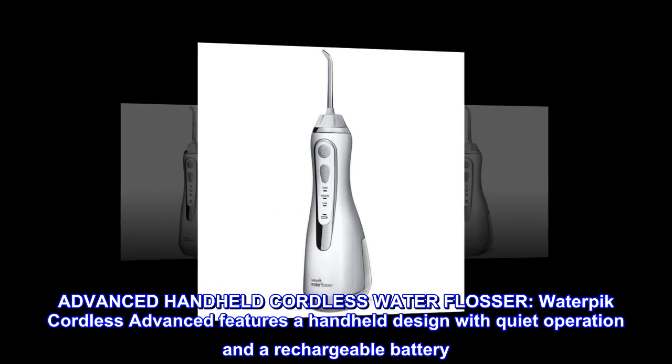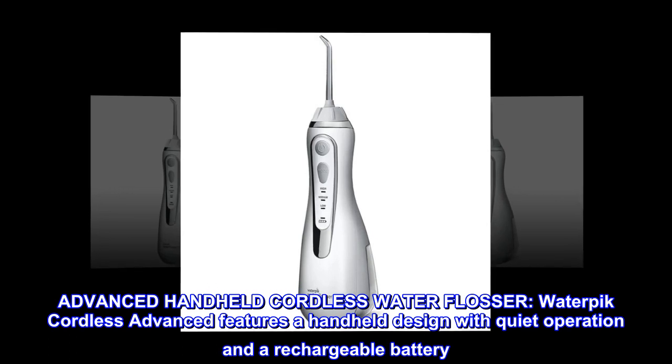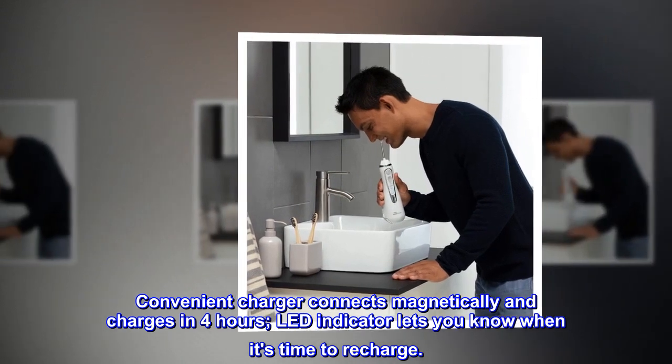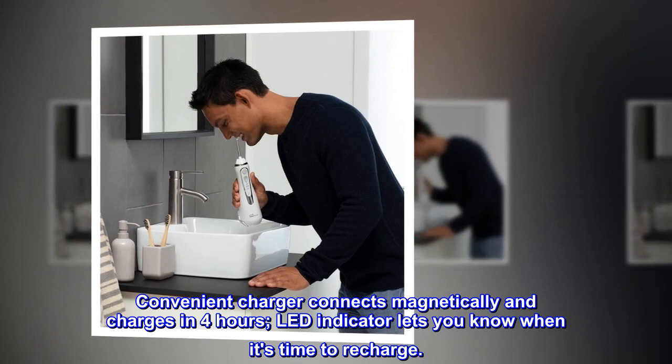Advanced Handheld Cordless Water Flosser. The Waterpik Cordless Advanced features a handheld design with quiet operation and a rechargeable battery. A convenient charger connects magnetically and charges in 4 hours. An LED indicator lets you know when it's time to recharge.